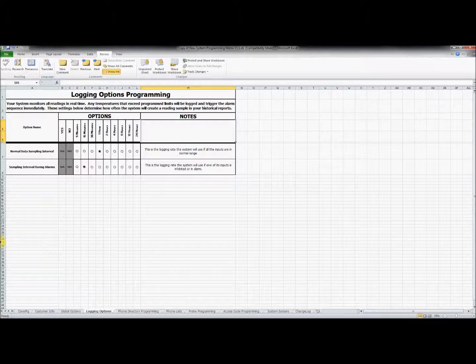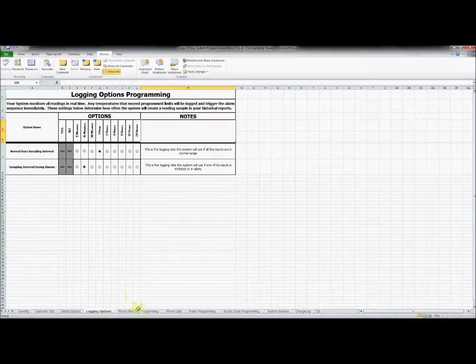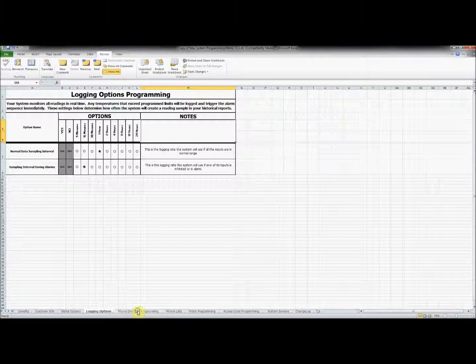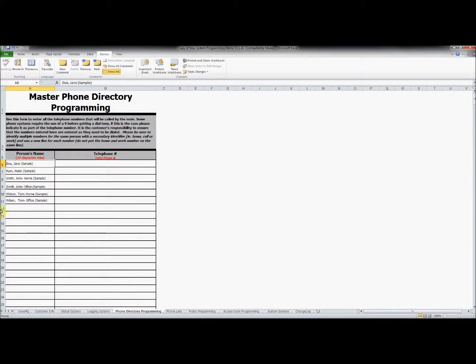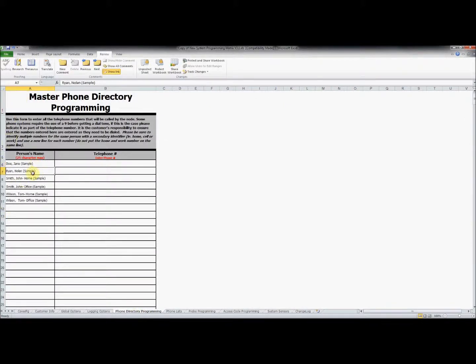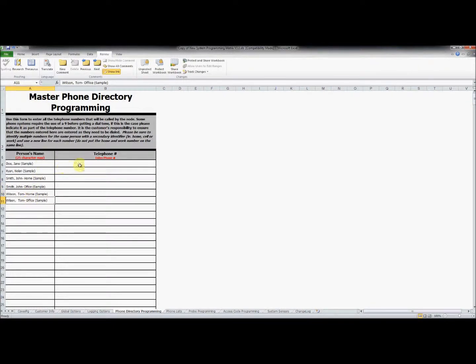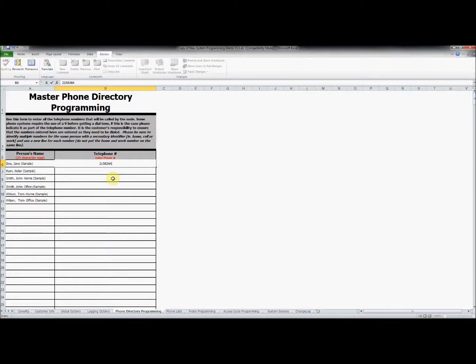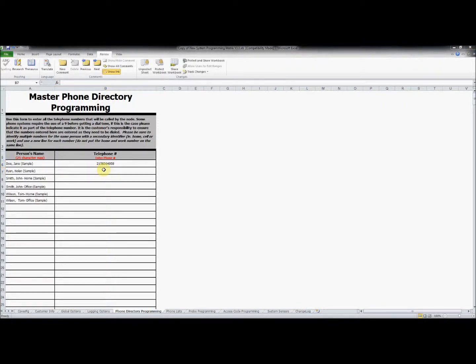In addition to email notifications, we can also notify people by phone when an input goes into alarm in the phone directory programming tab. Remove the sample names and enter any contacts that you might want the system to notify. Be sure to include any necessary digits to dial out of the building if necessary. For demonstration purposes, I'm going to leave the sample names and just add phone numbers.